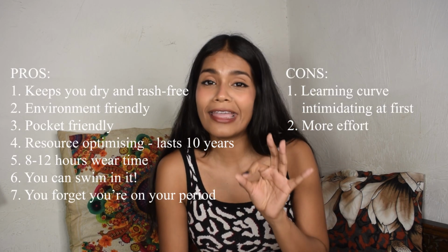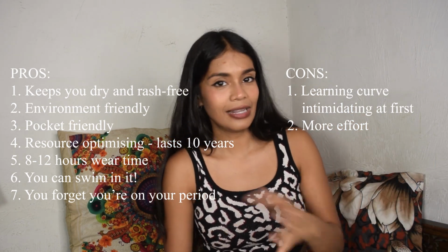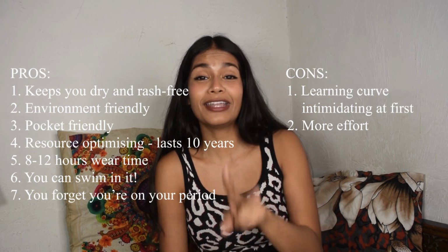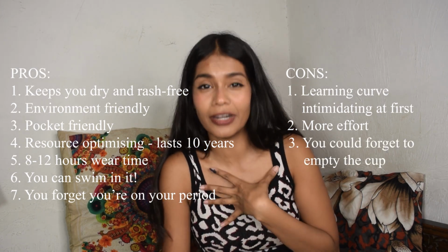Number 3 is a pro and a con, which is you may forget that you're on your period. Now, forgetting that you're on your period is great. I think that's a pro, but forgetting to empty your cup because you forgot you're on your period is a con. Don't do that. I've done it before. I've left my cup in for a little bit over 24 hours also because I just forgot. And that's not good. Nothing happened, but just because the risk of infection is lower here doesn't mean we take it for granted. Empty it out within 12 hours. But yeah, that could be a pro and a con.